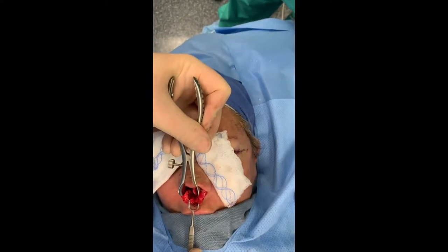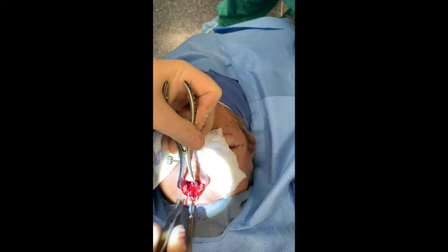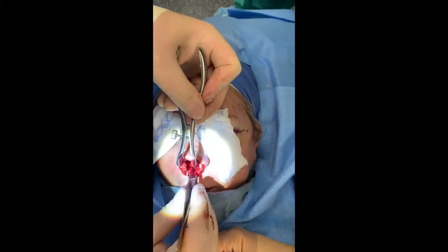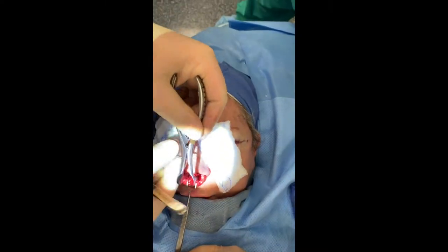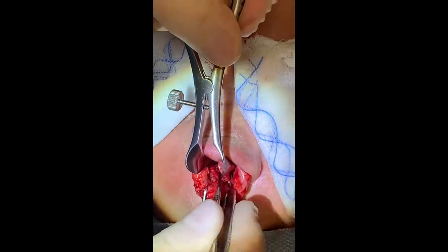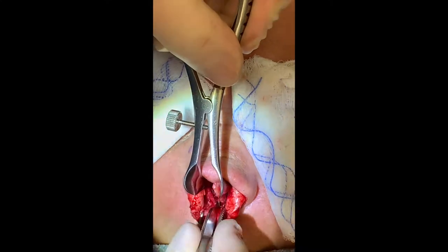The video has been put in fast playback mode to compress the video playing time. Here, assessing the position of the caudal septum, which remains deviated to the left.